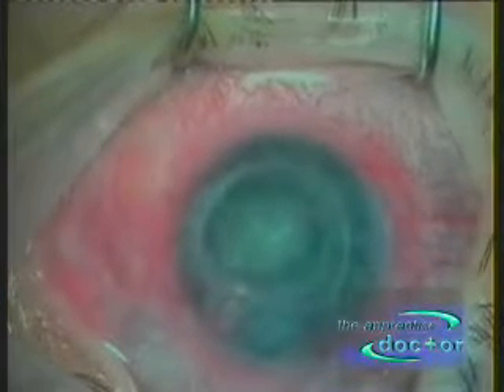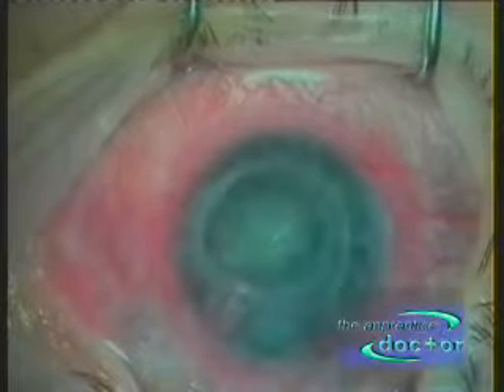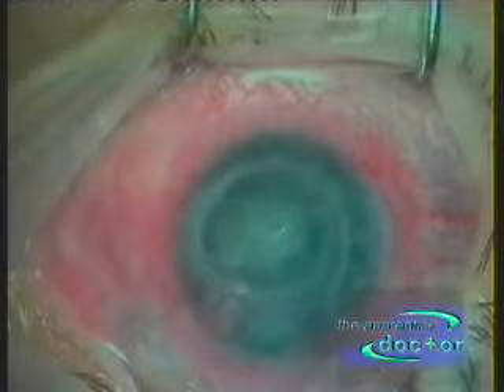With the patient under general anesthetic, the operative field is prepared with antiseptic eye drops and sterile drapes. The upper and lower eyelids are retracted by specially designed eyelid retractors.